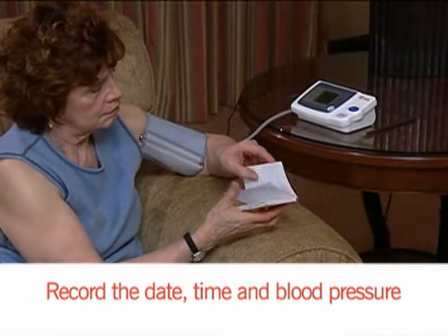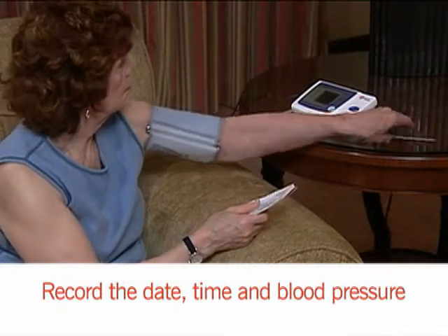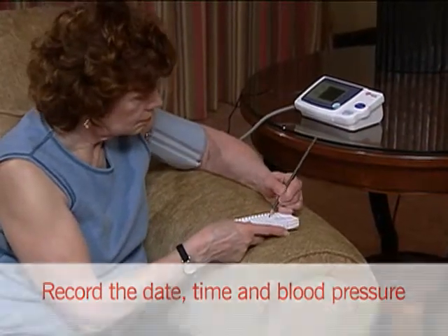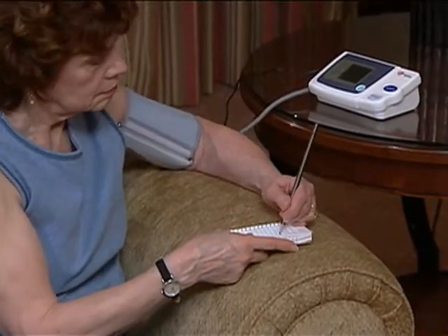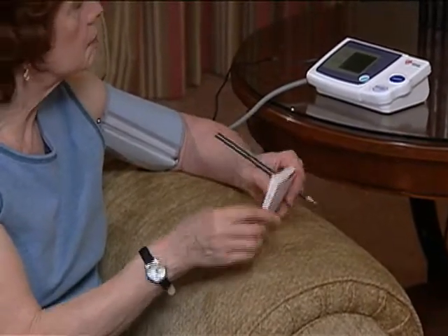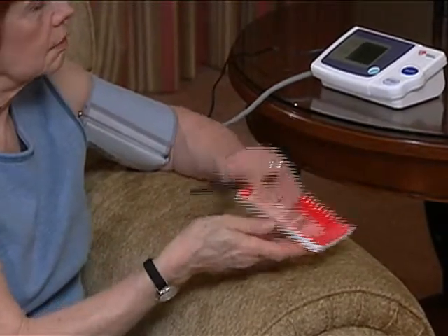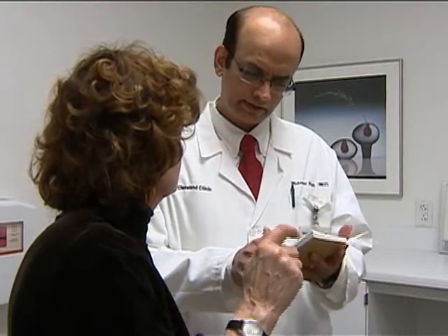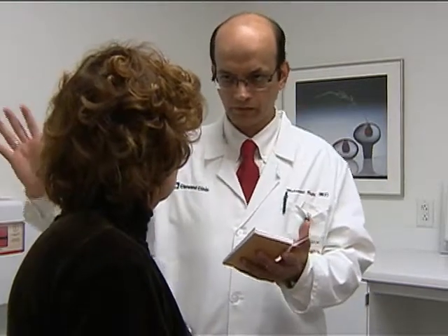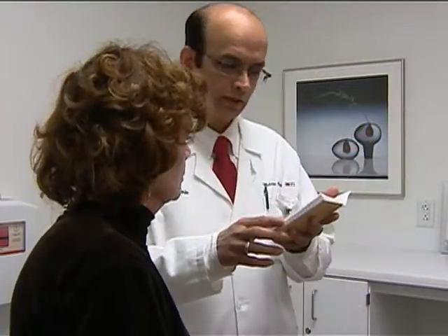Record the date, the time, and your systolic and diastolic pressures in a notebook or diary. Before your next doctor's appointment, you should record at least 2 morning and 2 evening readings every day for 1 week. Throw out the readings of the first day. This will give you a total of 24 readings. Your doctor can use these readings to help make decisions about your treatment. And always remember, while monitoring your blood pressure at home can help your doctor evaluate your health and treatment, it is not a substitute for regular checkups.